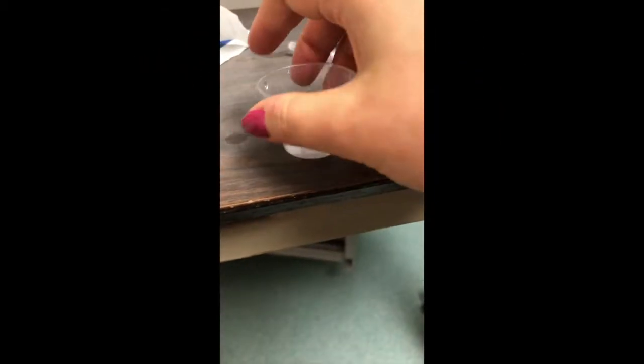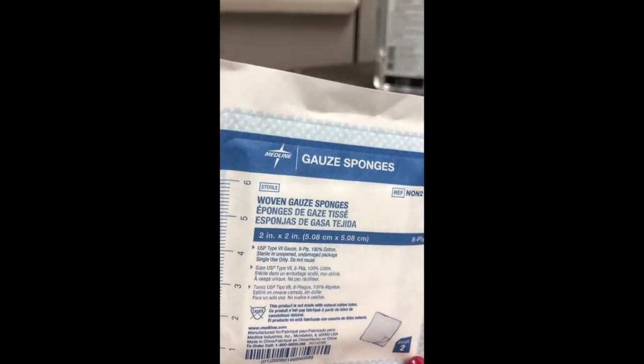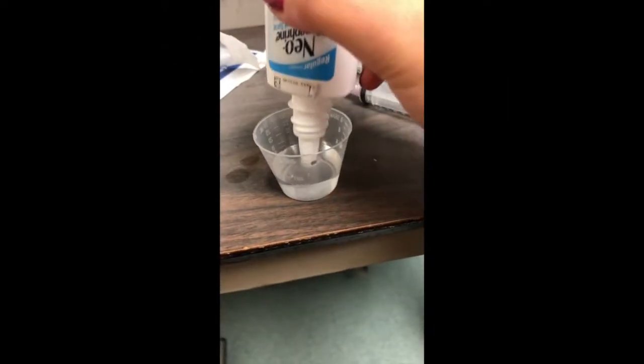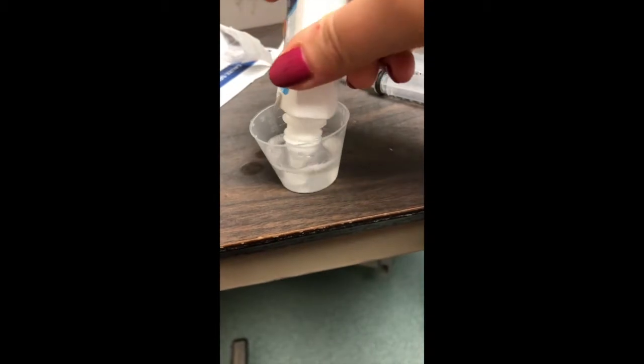As you can see I have my mixture here in the cup — this is only a little bit of it, because I'm going to save the other portion for my packing, which will eventually be placed into the nose. The next step of this process is to use the bottle that you have left over to suck the mixture back into the bottle itself.